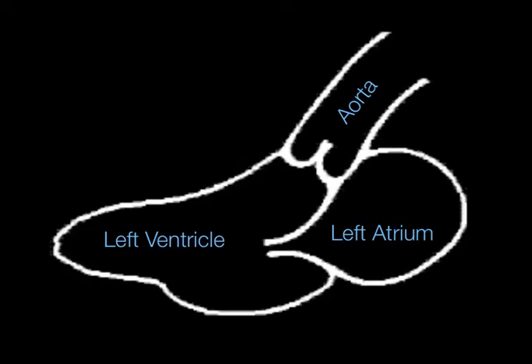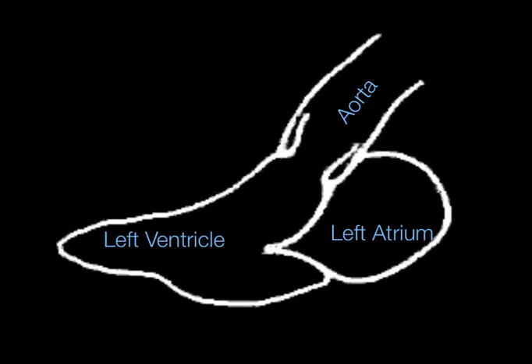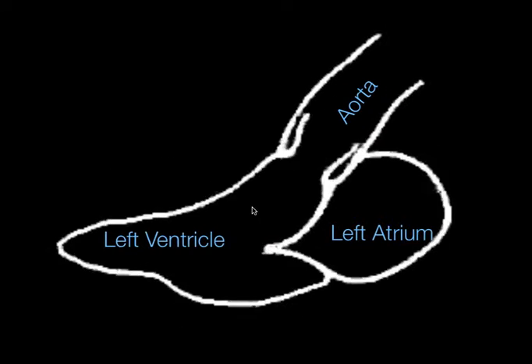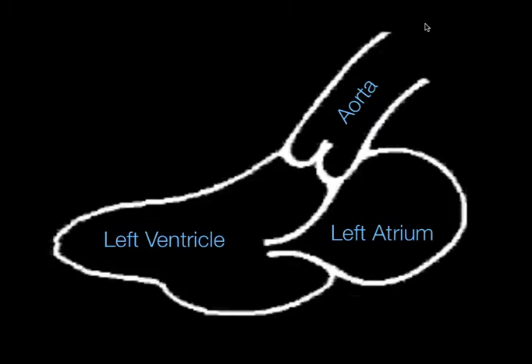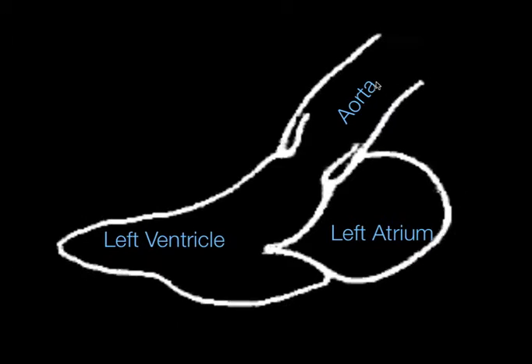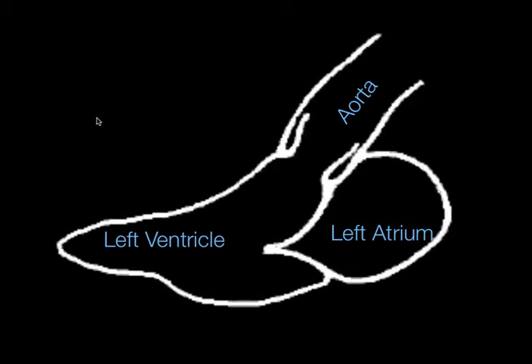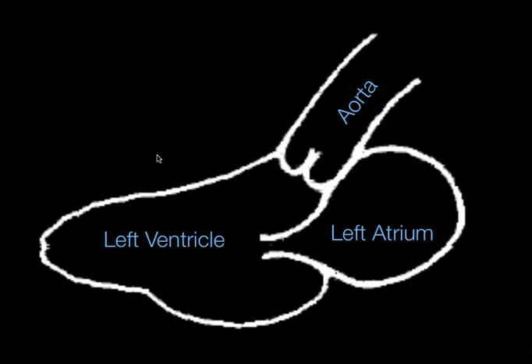And this is not an ultrasound. This is just a schematic diagram demonstrating systole and diastole. So when the heart squeezes, that systole, it squeezes its contents out of the aorta, and out through the aorta, I should say, and during diastole is when it fills. And you can see that during diastole the valves open and the heart fills with blood. And this is the septum seen here. And the right ventricle, not pictured, would be right up here, parasternal long axis.